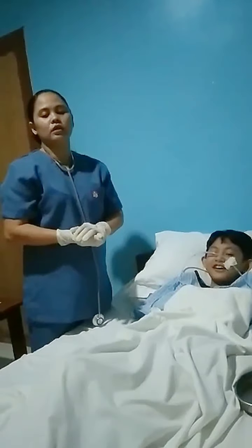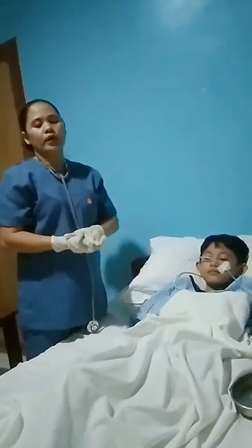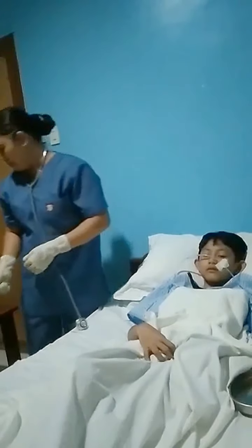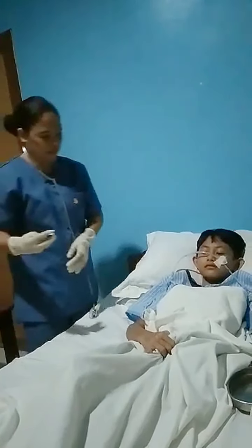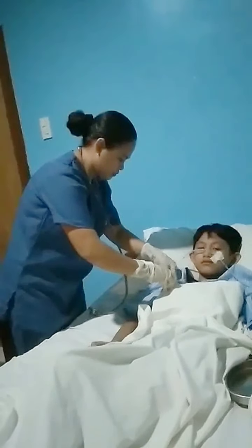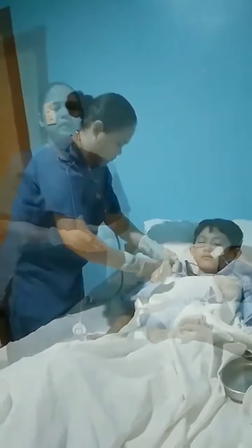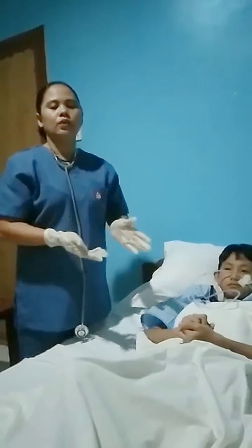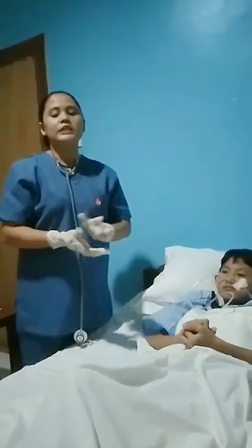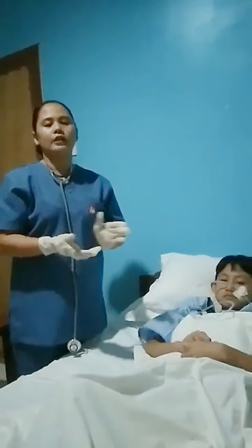Furthermore, we have to keep the end of the lumen plugged at all times. Secure the tubings, coil the free end, then pin it to the clothing. Pinning it to the clothing will make sure that the tube will not be dislodged upon movement. Next is to put the patient in a comfortable position that will make the patient feel better and alleviate anxiety.